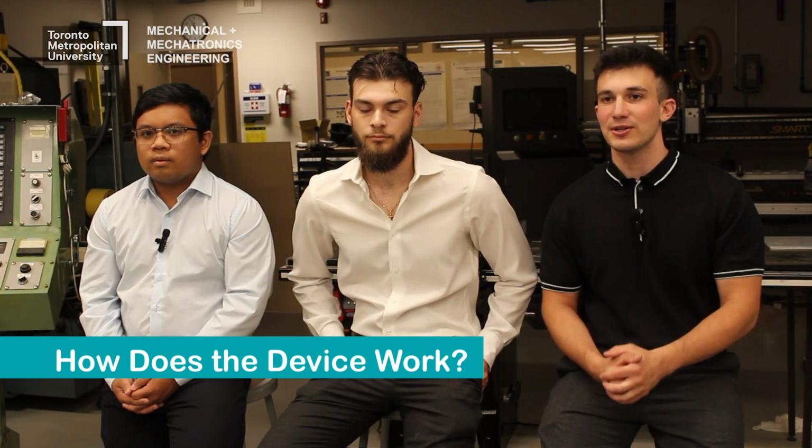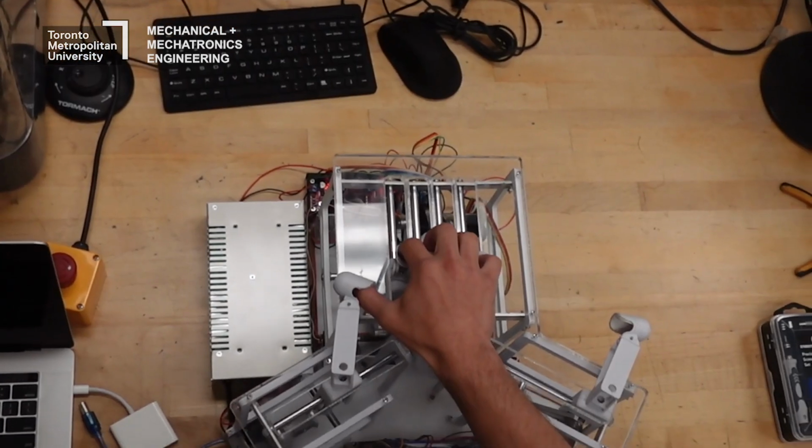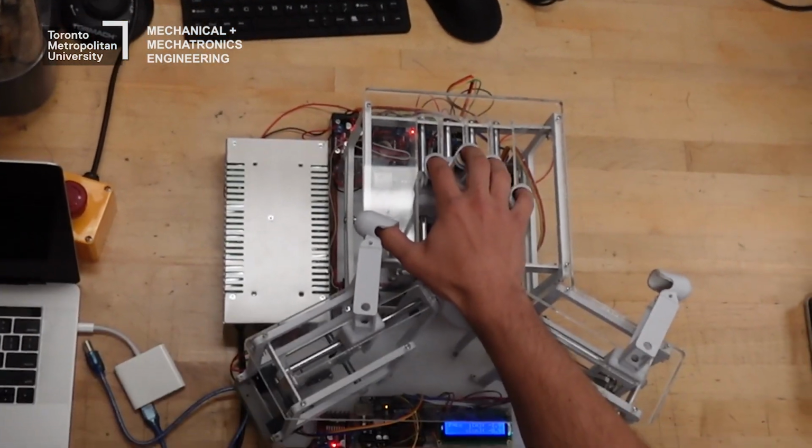The way our device works is essentially the user would put their hand in, they would wiggle around their fingers until they reached a certain point that we wanted to restrict their movement. At that point, the encoders would be able to sense that position. They would send the message to the Arduino, which we're using to control the device, and then that would send a message to our motors to apply a force in the opposite direction to restrict that.